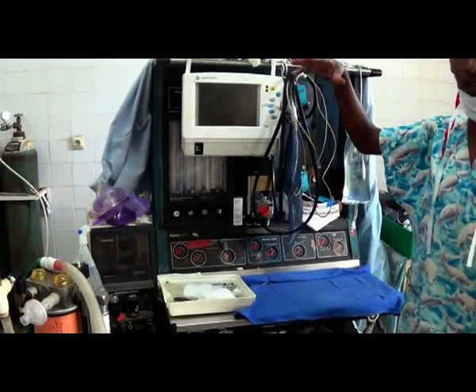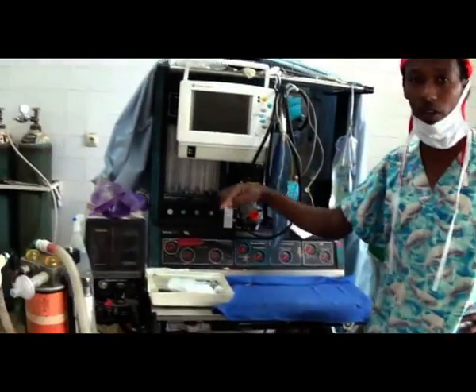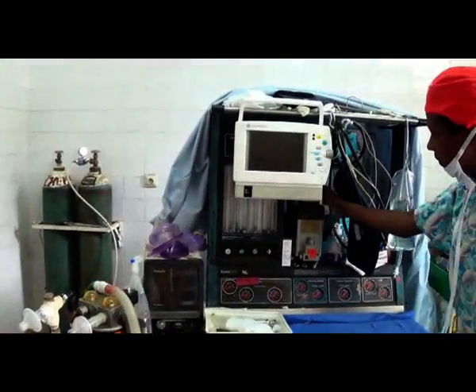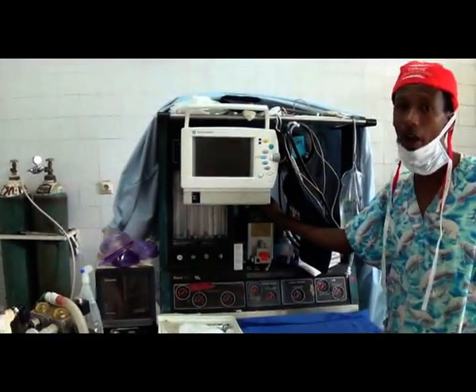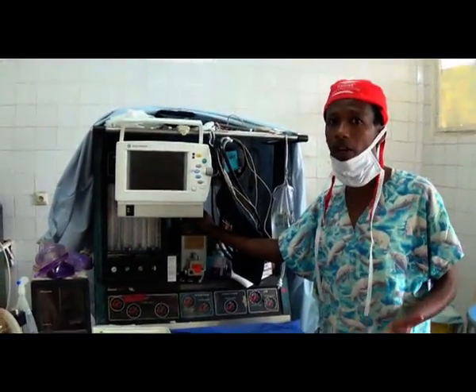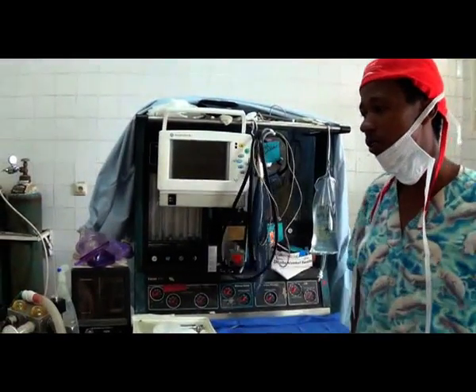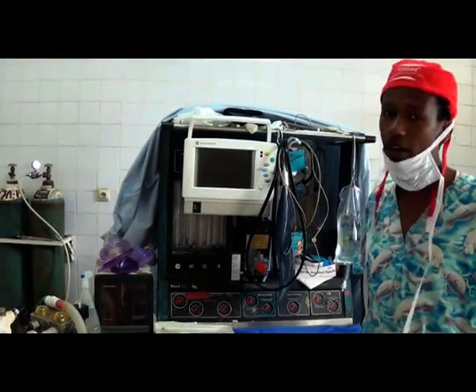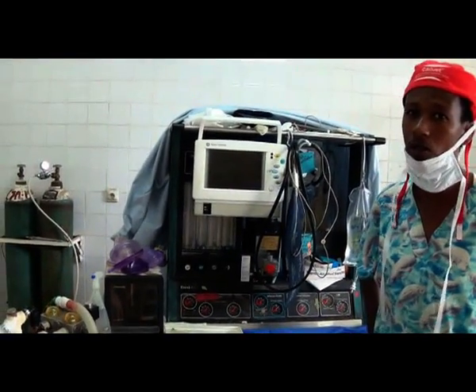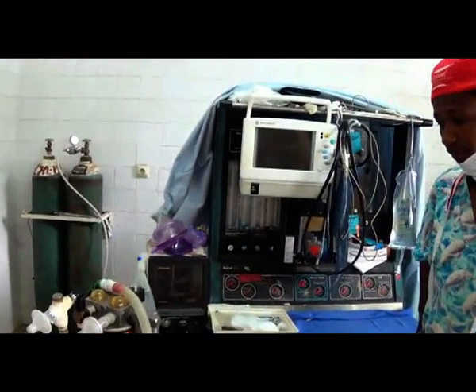I should increase the dose of the inhalational agent because the machine has its own leak. The thing I have put for the patient here did not reach my patient, so I need to increase the dose. The machine has a leak, and I don't think any new anesthetist to this hospital can handle this patient with this machine. The patient may lose his life. Oh, this is very dangerous.